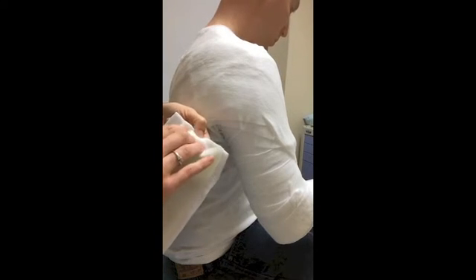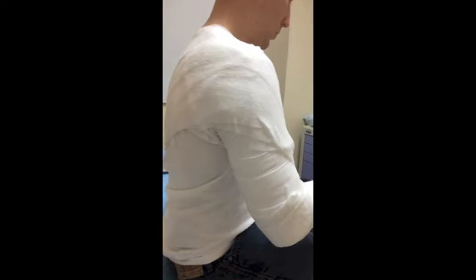We'll roll the ends of this splint in, same as before, making sure that we're not going to give that patient any fiberglass splinters. The size of the orthoglass you pick will vary based on the size of the patient. For training purposes, we are using 3-inch today. For a patient of this size, generally we'd probably opt for a 4-inch, but it does just depend on the size of the patient.